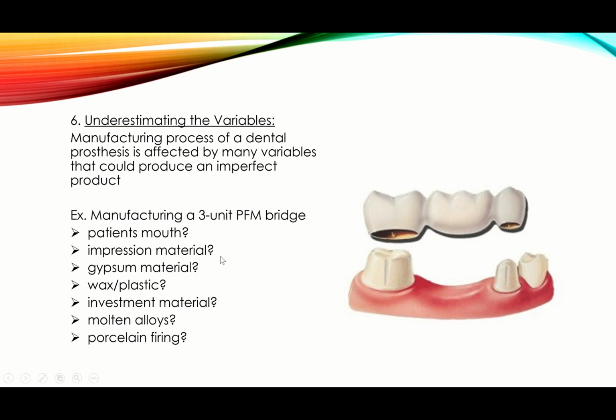All right, impression materials. What happens to all kinds of impression materials on Earth? They all shrink. No matter how soon, no matter if they're rubber or alginate, at the end of the day, they do shrink. By a little bit. By too much, it's not my concern now, but they do shrink.